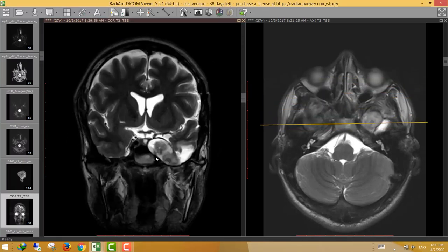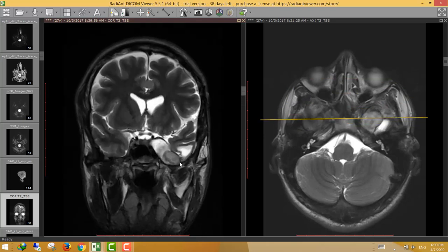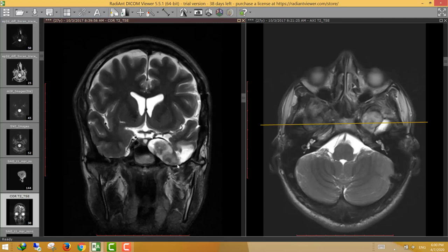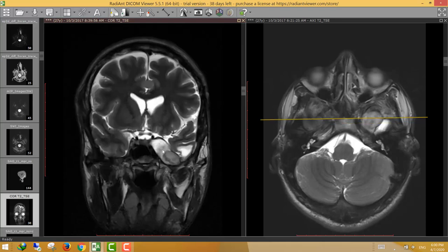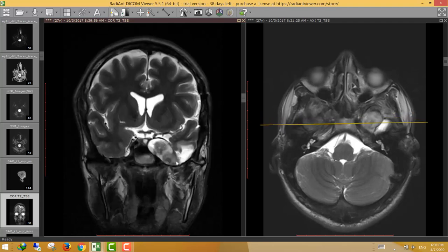On coronal T2 images, this is the left paracavernous fairly well-defined lesion, and this is the inferior extension along the foramen ovale, which is present at the floor of the middle cranial fossa. The foramen ovale contains one of the most important nerves passing through it — the mandibular nerve, which is one of the three terminal branches of the trigeminal ganglion. So this lesion is extended along the course of the mandibular nerve.